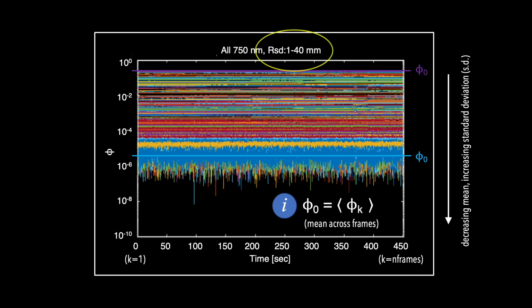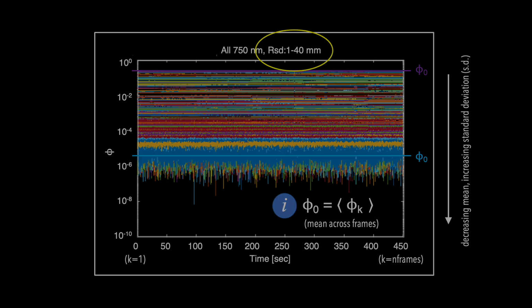A default maximum separation distance of 40 millimeters is applied when selecting the channels that appear in the raw data plot. This provides a good overview of most data, although the parameter can be customized in the processing script. A proper maximum RSD value will be calculated based on QA metrics. These are presented in the next section.